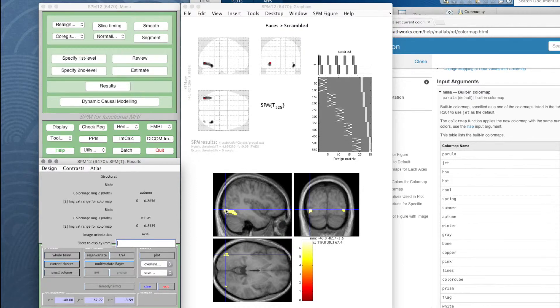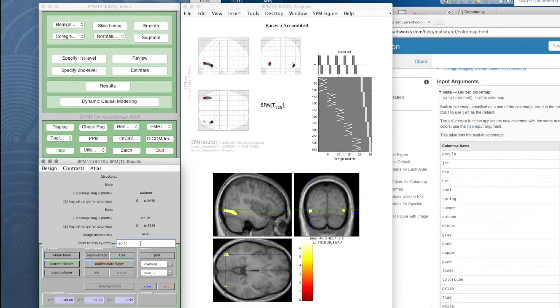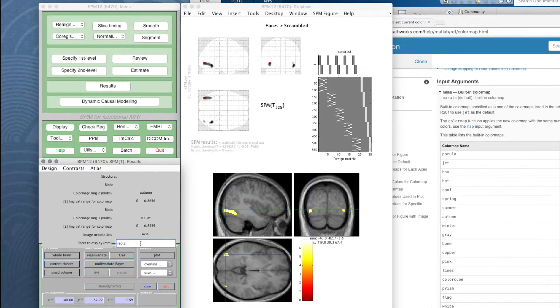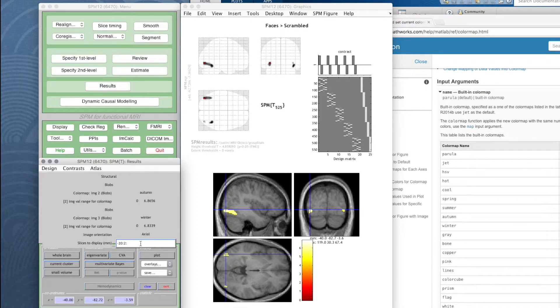We think they go from about minus 20 on the z. Now we could go up in steps of one millimeter at a time because our structural image has one millimeter resolution, but our functional images on which the stats were done only have two millimeter resolution. The original images were three millimeter resolution but when we normalized we resliced to two millimeter resolution. There's no point going up in one millimeters because every other image would be identical to the previous one.